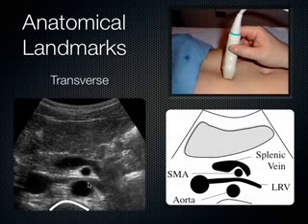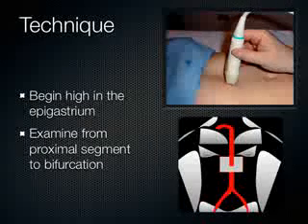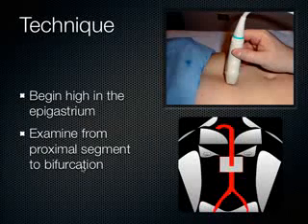The other thing is, what's getting nut-cracked between the aorta and the SMA? What's this little blood vessel here that's trying to get into the IVC? That's the left renal vein. So the kidney's kind of off the screen. We don't see it here. But we do see the left renal vein get nut-cracked between aorta and SMA. Cool? All right.